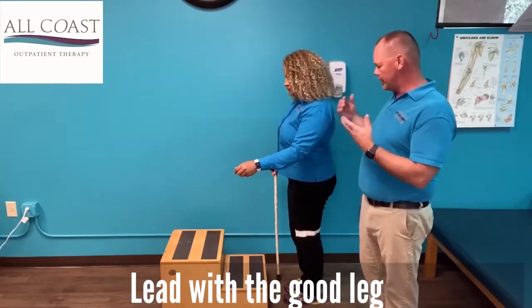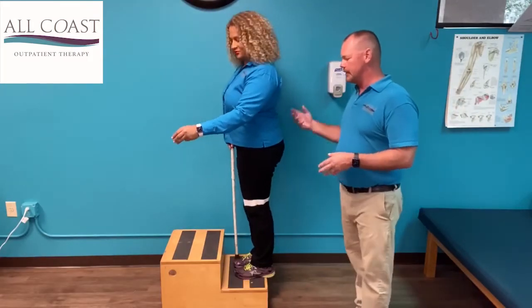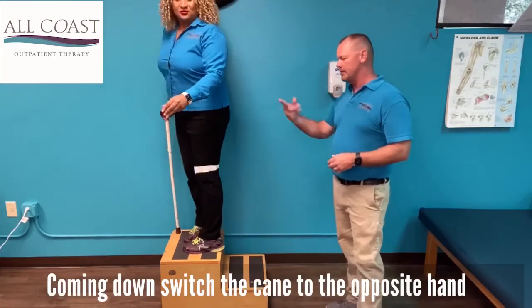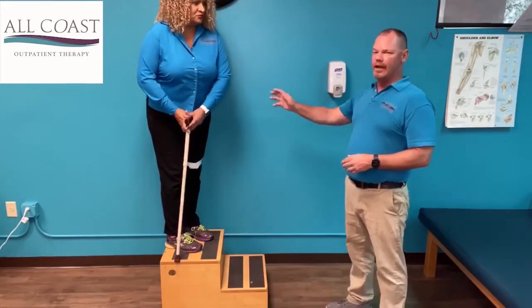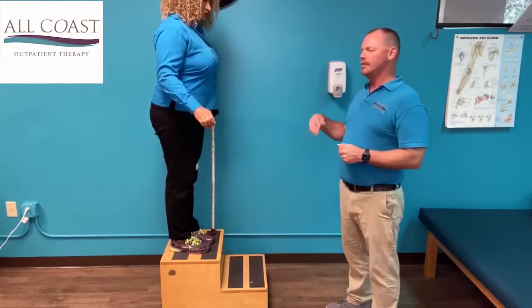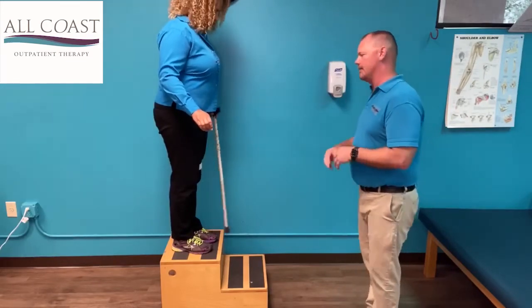We're going to lead with the good leg — there you go. Lead with the good leg, then comes the cane and the bad leg. But when you're coming down, you still have that rail on that side, so you're going to have to switch the cane into the other hand at this time. Hold the rail — it's still the same sequence. The bad leg still has to come down first at that time.